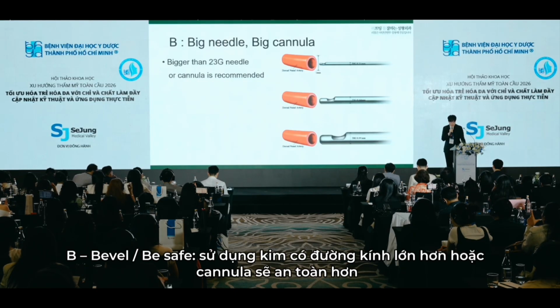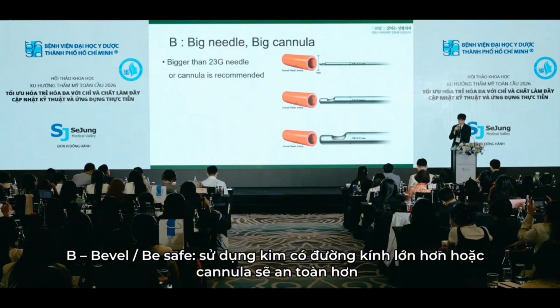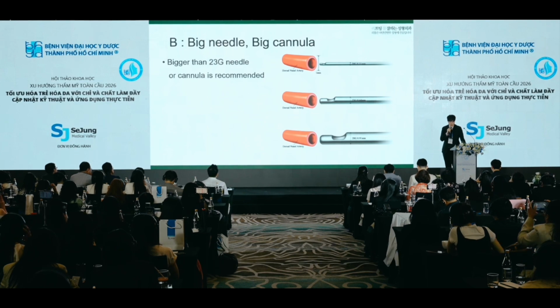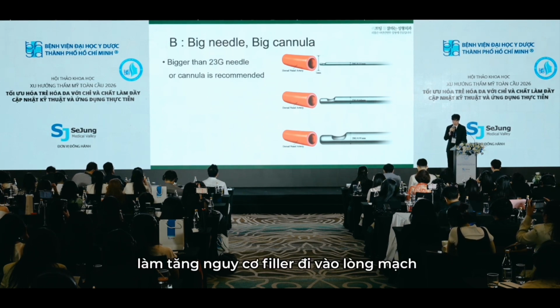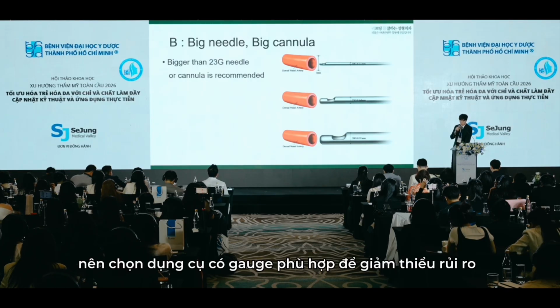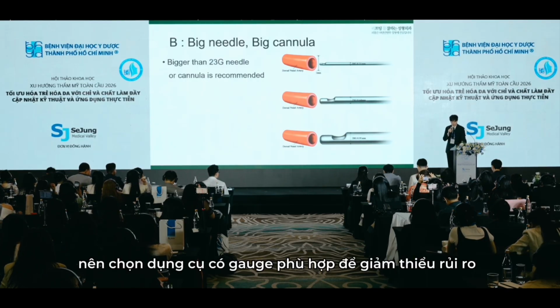B is big. Using a large diameter needle or cannula is safer. Small needles can easily penetrate vessel walls, increasing the risk of intravascular filler injection. Therefore, a large gauge instrument is recommended to minimize the risk.